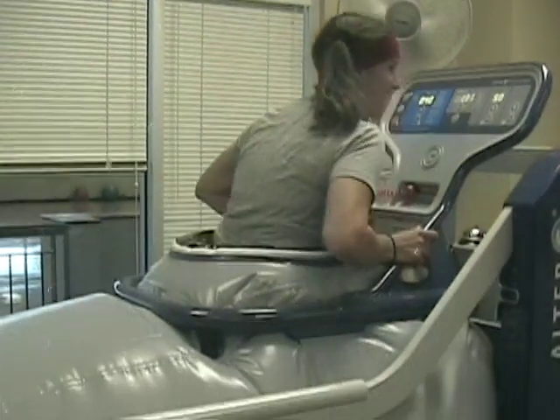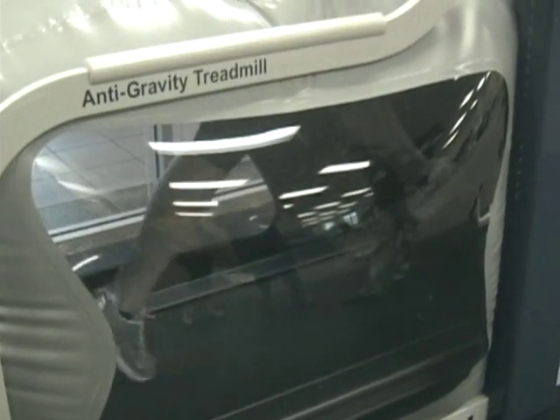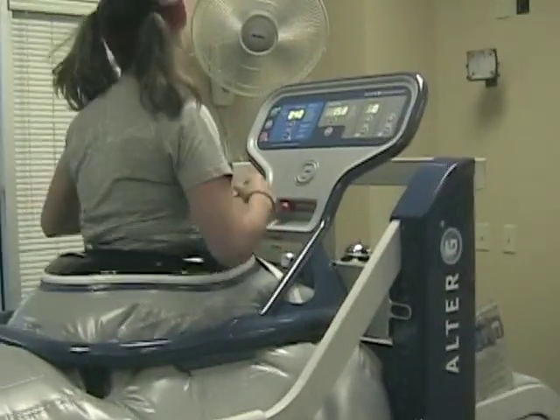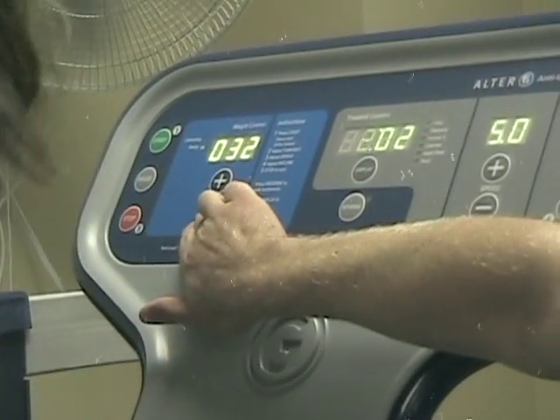The Alter-G is even fun for the patients. The advanced control panel makes operating the Alter-G simple. Speed, time, and body weight percentage can all be adjusted here.